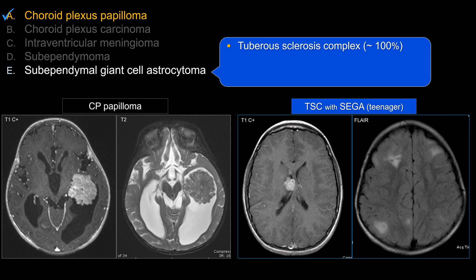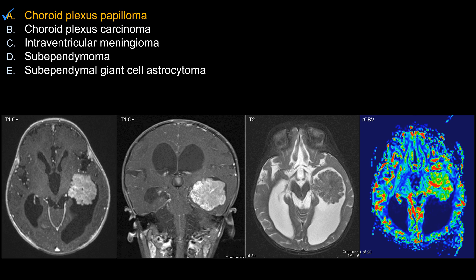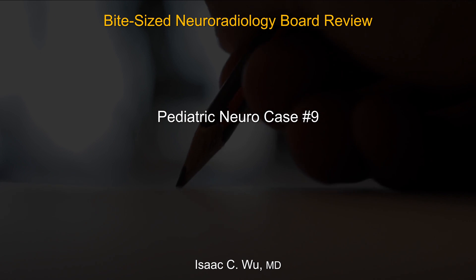Lastly, subependymal giant cell astrocytoma. For this, you should see other findings associated with tuberous sclerosis, such as cortical and subcortical tubers and other subependymal nodules. It is very uncommon to see a subependymal giant cell astrocytoma in a patient without tuberous sclerosis. The key feature is that it's greater than one centimeter and usually located around the foramen of Monro, so it can cause obstruction. This is a pediatric disease occurring in young patients with tuberous sclerosis. That is all for choroid plexus papilloma — thanks for your attention and good luck on your board exam.